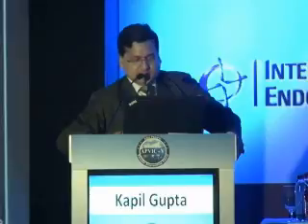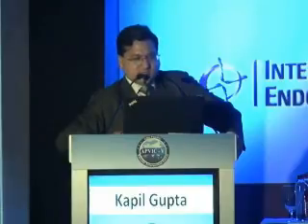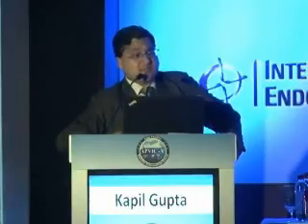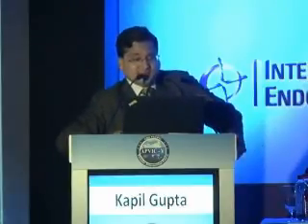And this is the final angiogram that we obtained with good flow across the TP trunk into the PTA with a good runoff, no contrast hold up. I just want to show you the distal runoff was significant. The patient has been in follow-up. This case was done almost 15 months back, and the patient still came to me last month with a good postoperative pulse. All his wounds are healed and he is in a working state.